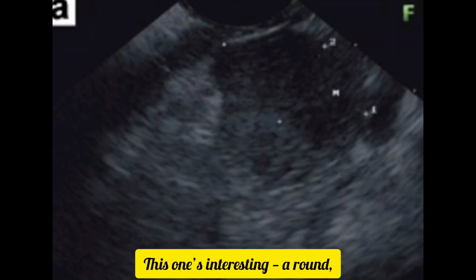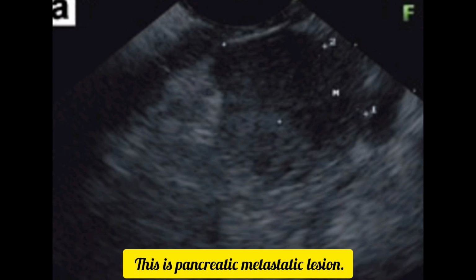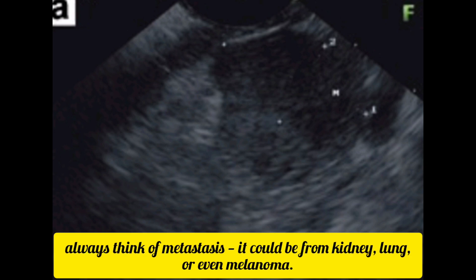This one's interesting. A round, homogeneous, well-defined hypoechoic lesion. This is a pancreatic metastatic lesion. Unlike primary tumors, metastases usually look neat and symmetrical, often multiple and well-circumscribed. If you see a too-perfect pancreatic mass, always think of metastasis. It could be from kidney, lung, or even melanoma.